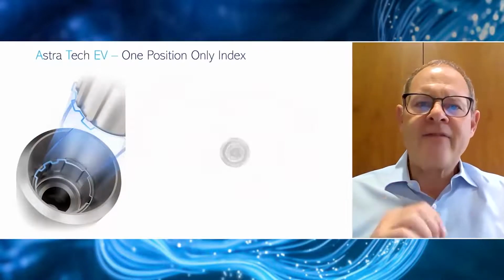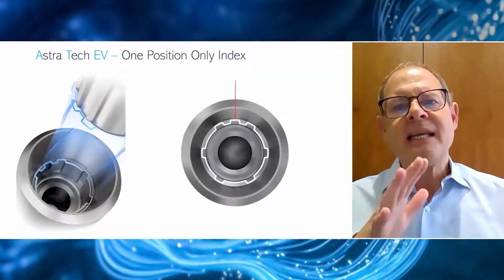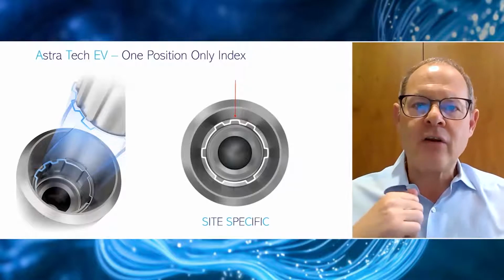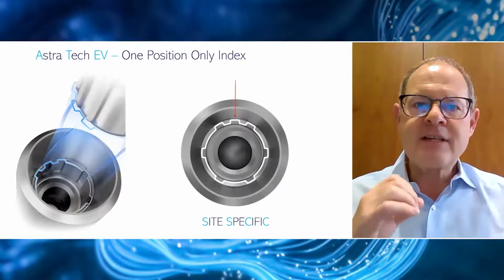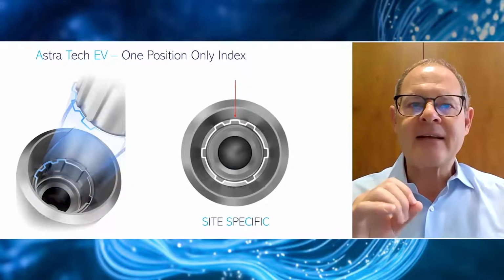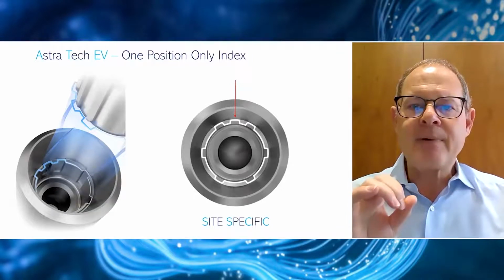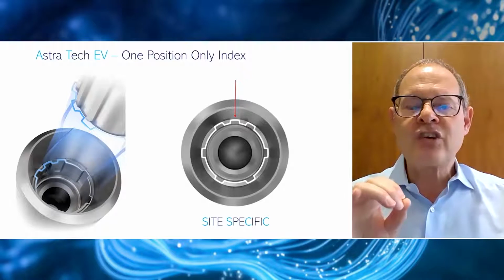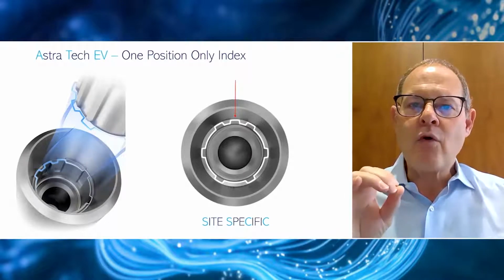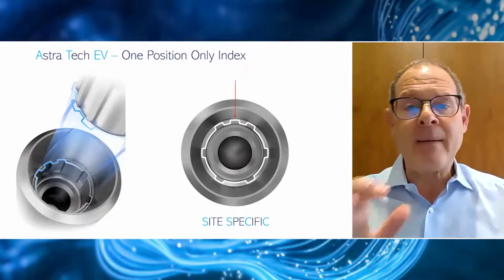One of the things that I feel is very much overlooked in the digital world is the fact that we should be using an implant that is specifically designed for these digital technologies. And right now, as far as I can see, there is only 1 implant on the market that has done that, which is the Astra Tech EV implant, because this is the only implant that offers you a 1 position only site-specific index, really designed for utilizing site-specific abutments, CAD/CAM abutments.